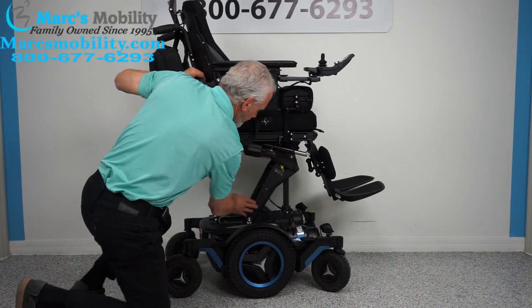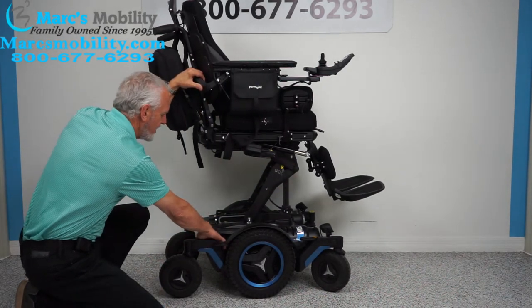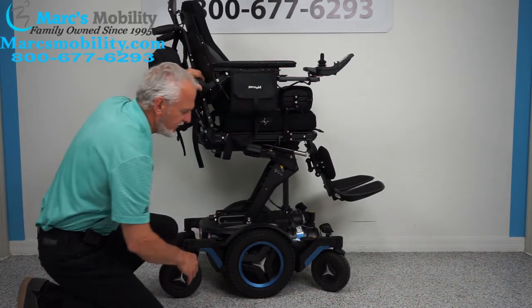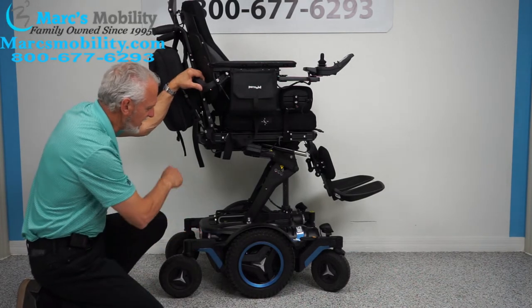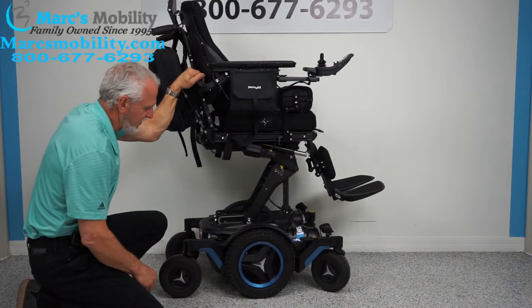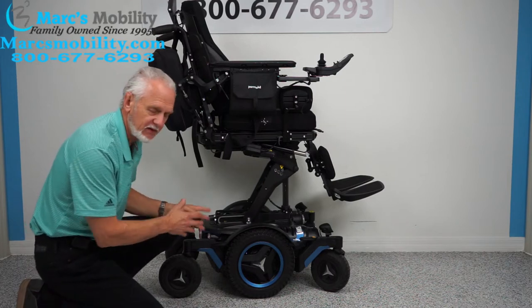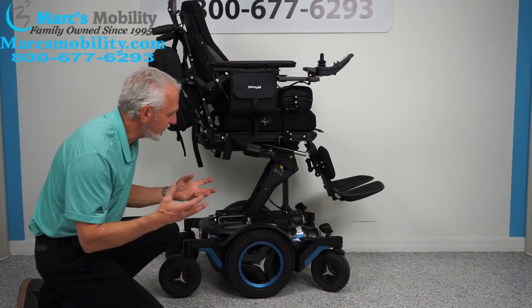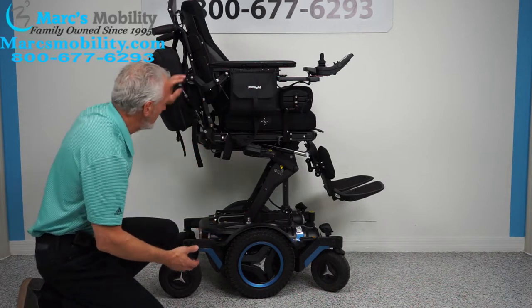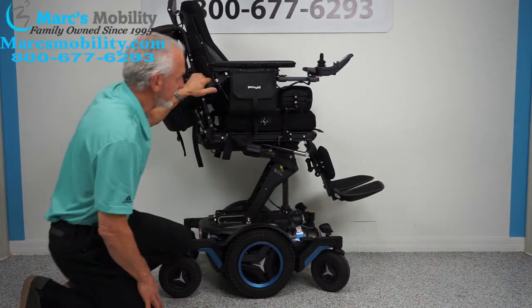You can see the actuator right here for the seat lift and how it's built. You have anchor points here and here — this is where you secure the chair for transport, two on each side. There's suspension in the back as well. This chair weighs about 435 pounds, plus a 200-pound person — that's roughly 635 pounds on those shocks. That's how you get that fantastic ride.